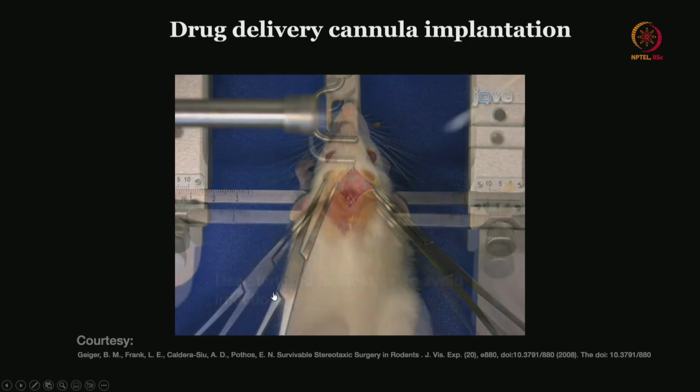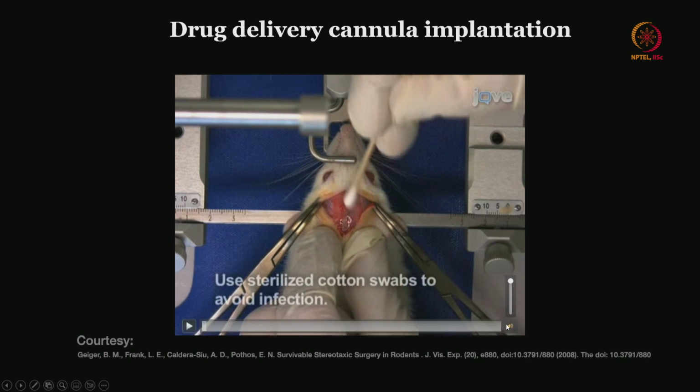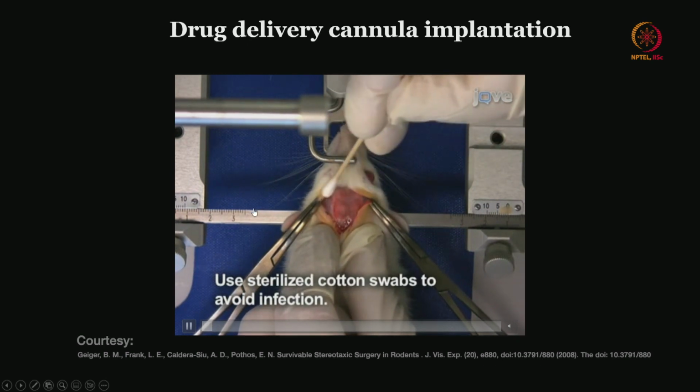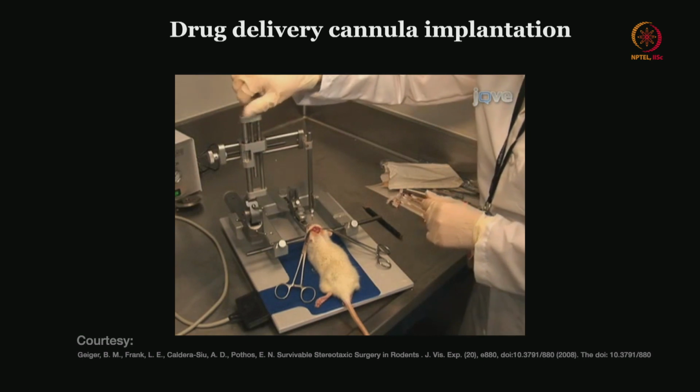Alright. So here I will just try to mute this. This is one of the videos taken from the JoVE itself, a wonderful video which will tell you how to perform the survivable stereotactic surgery.